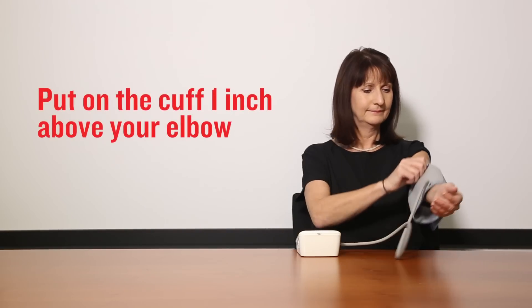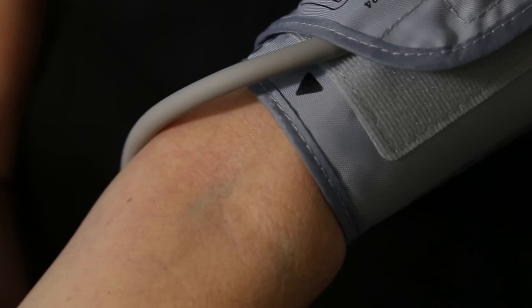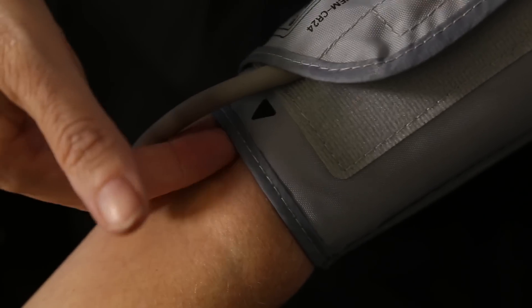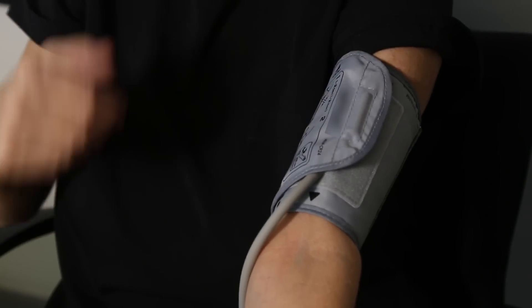Put on the blood pressure cuff with the bottom one inch above your elbow. The tubing or arrow mark should be in the centre of the front of your arm. Tighten the cuff so you can just fit in two fingertips, and make sure it is evenly tight at the top and the bottom.